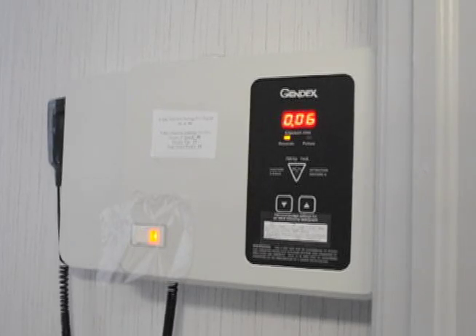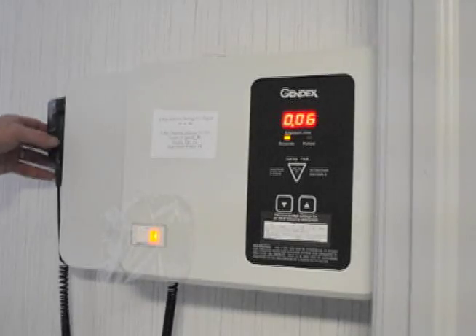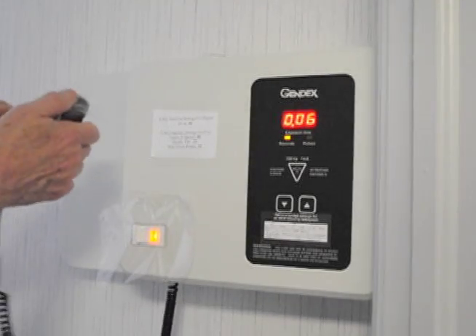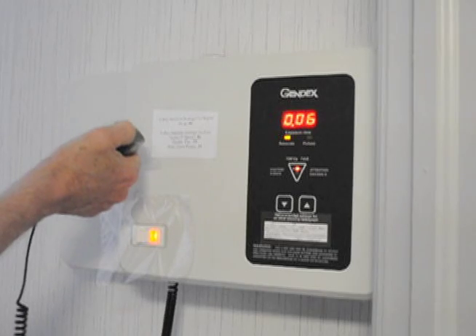Okay, now we will shoot an x-ray. This is a Gendex GX770.